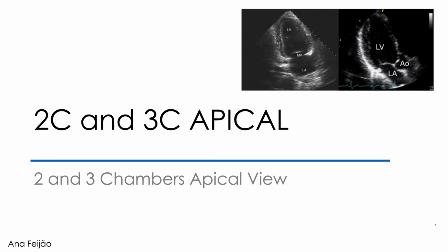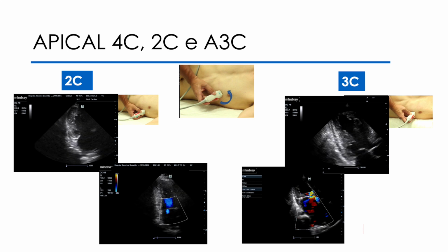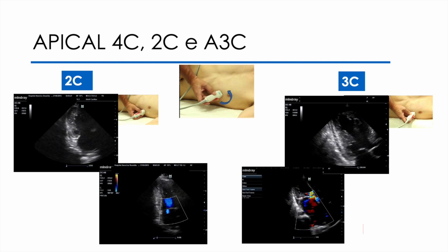So we evaluated the apical 4-chamber view and 5-chamber view. It remains to access the 2-chamber and 3-chamber views. Let's go. So the remaining apical views are important for us to understand the segmental function of the other walls and to understand how regurgitation behaves in 3 dimensions, or the dimensions of a mass, the mobility of a visualized structure, etc.